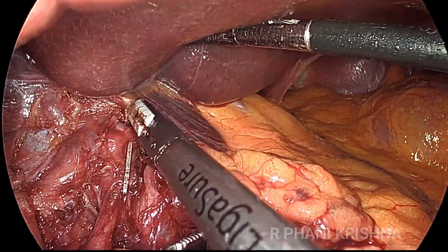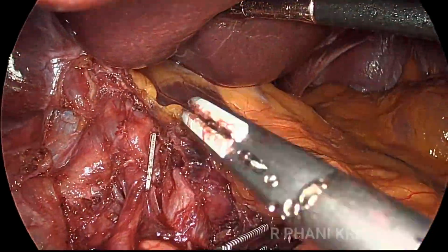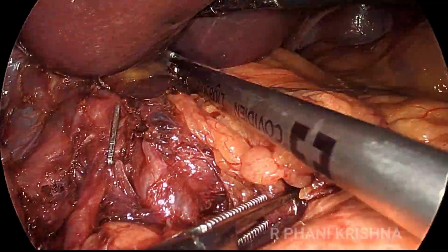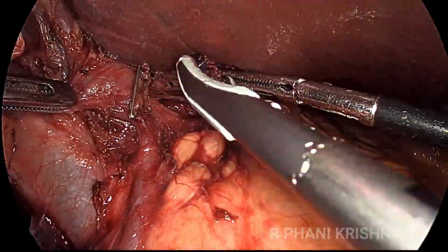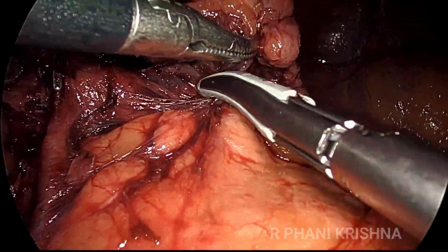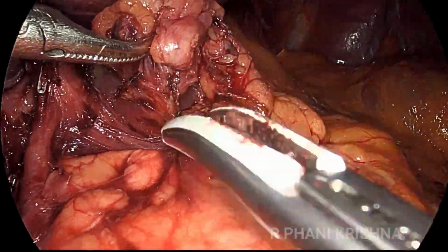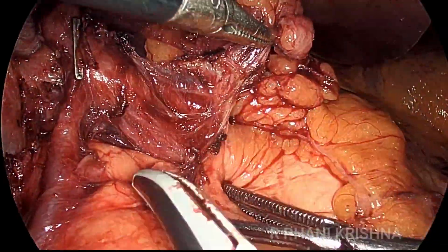the fibrofatty tissue and the lymphatic tissue is detached off the umbilical fissure. Then once this dissection is done, the dissection progresses from a medial to lateral fashion onto the common hepatic artery we identified there. We are now traveling on the common hepatic artery towards the celiac origin.